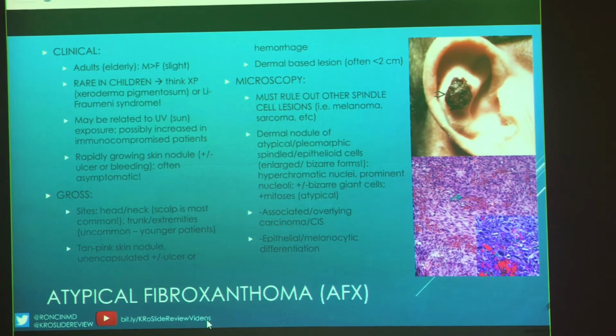So the epidermis in our case really was bland, but the top line is probably the most important on this case, where you must rule out other spindle cell lesions. So you need to rule out, okay, is this melanoma? Remember, we talked about UV exposure. Is this some type of sarcoma? All those types of things.